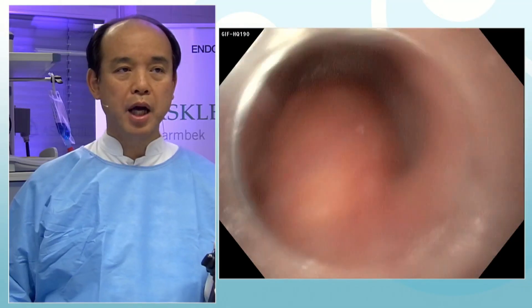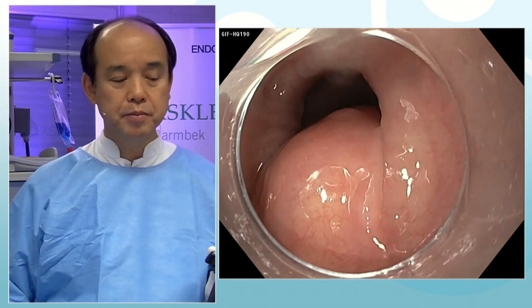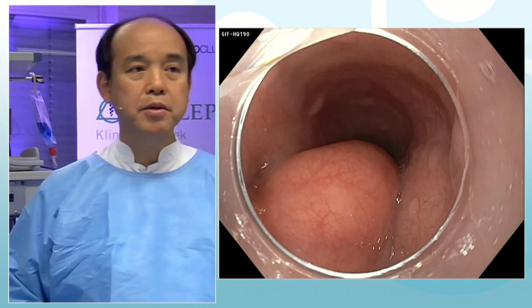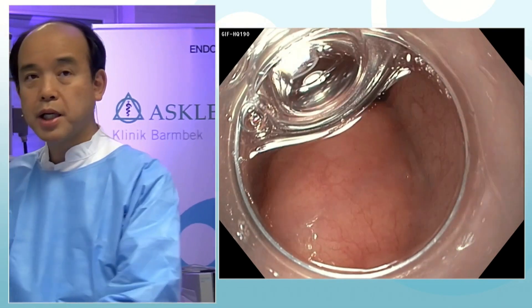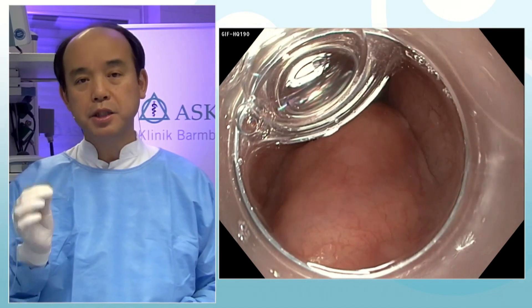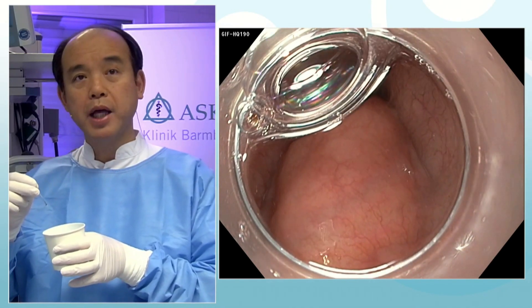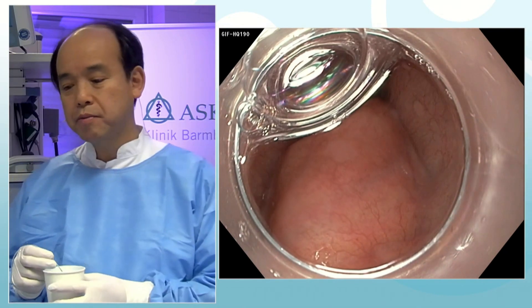I'm planning to start an ESD procedure to remove this big lesion, and today I'm planning to use several new Olympus materials, including the Dual Knife J. This is a brand new electrosurgical device — the Dual Knife J has injection capability: just by pressing the bottom of the foot switch, we can inject solution directly through the knife. It's very similar to the Flash Knife or Hybrid Knife.